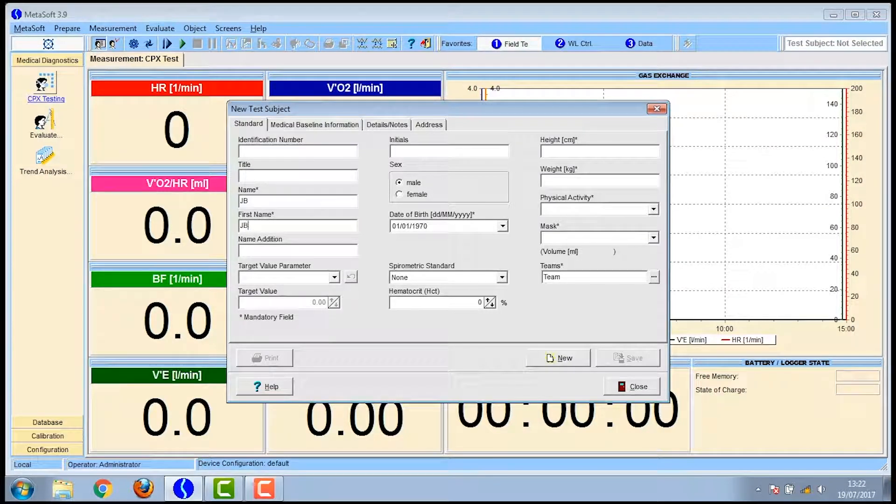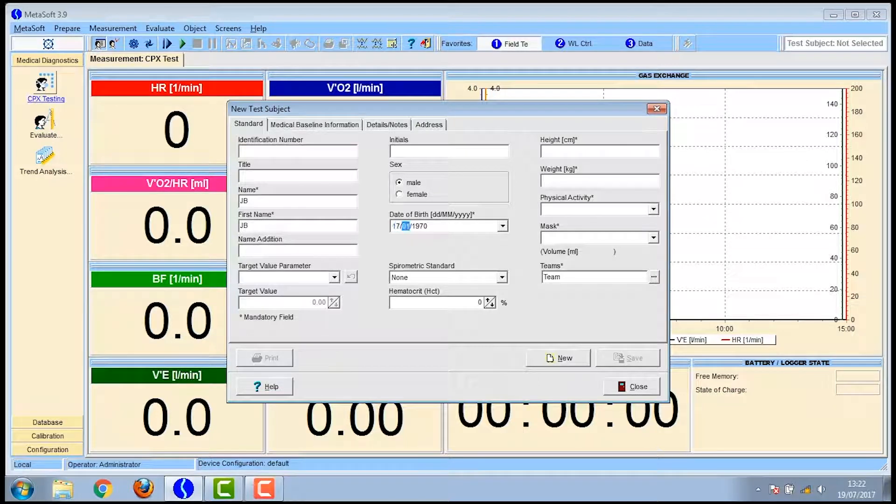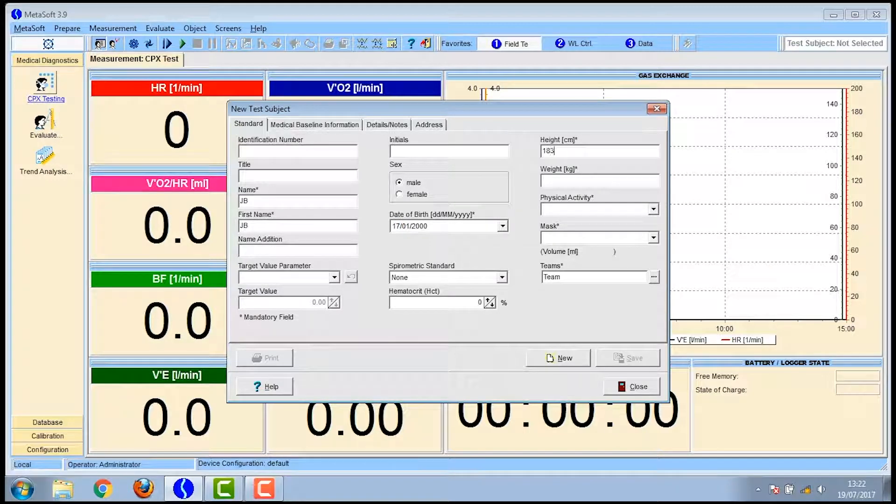You need to enter details into boxes with an asterisk. So we never use their real name and we often use initials or participant number. You'll need to input their date of birth as well as the height and weight. As you'll see these are the boxes with the asterisks.